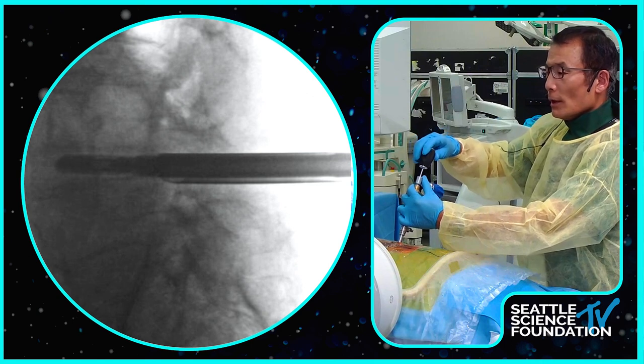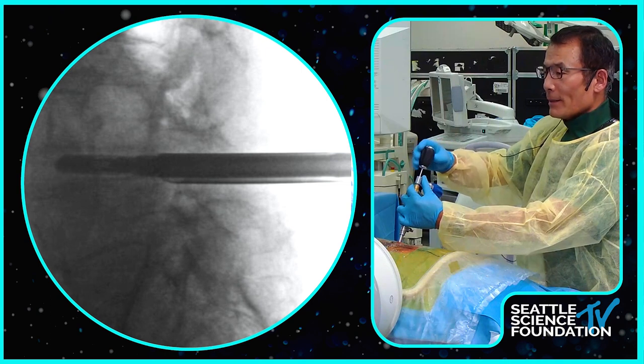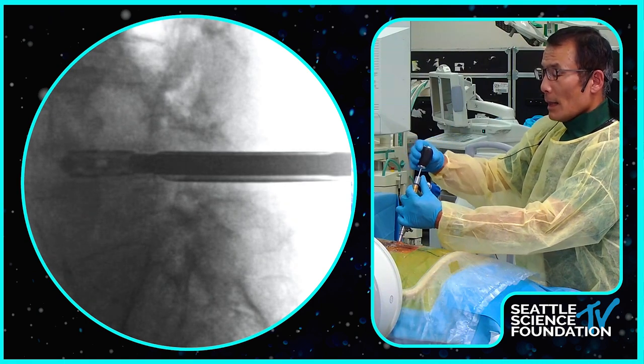Good question. So I do use them when the patient is young, has good bone quality, and has a pretty tall disc space. Because remember, if the disc space is really collapsed and the patient has poor bone quality, when you use those instruments, they're too aggressive, they can compromise the implant. So for those types of patients, I prefer doing discectomy under direct visualization with the endoscopic curette, shavers. As you can see, we can continue going up.